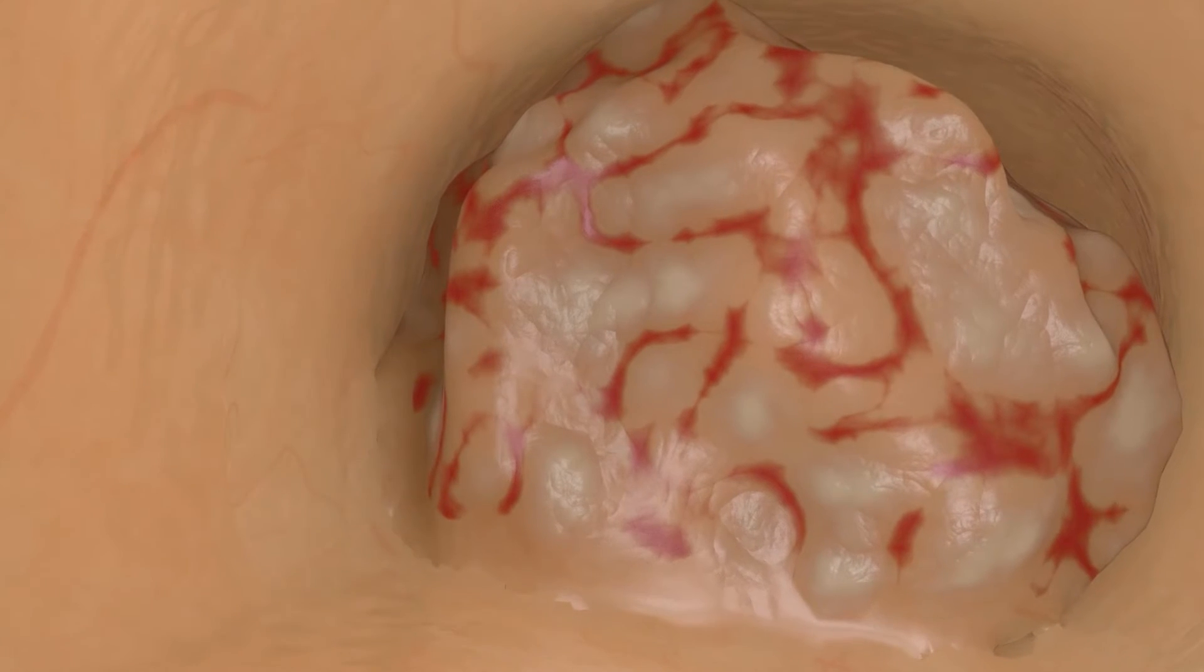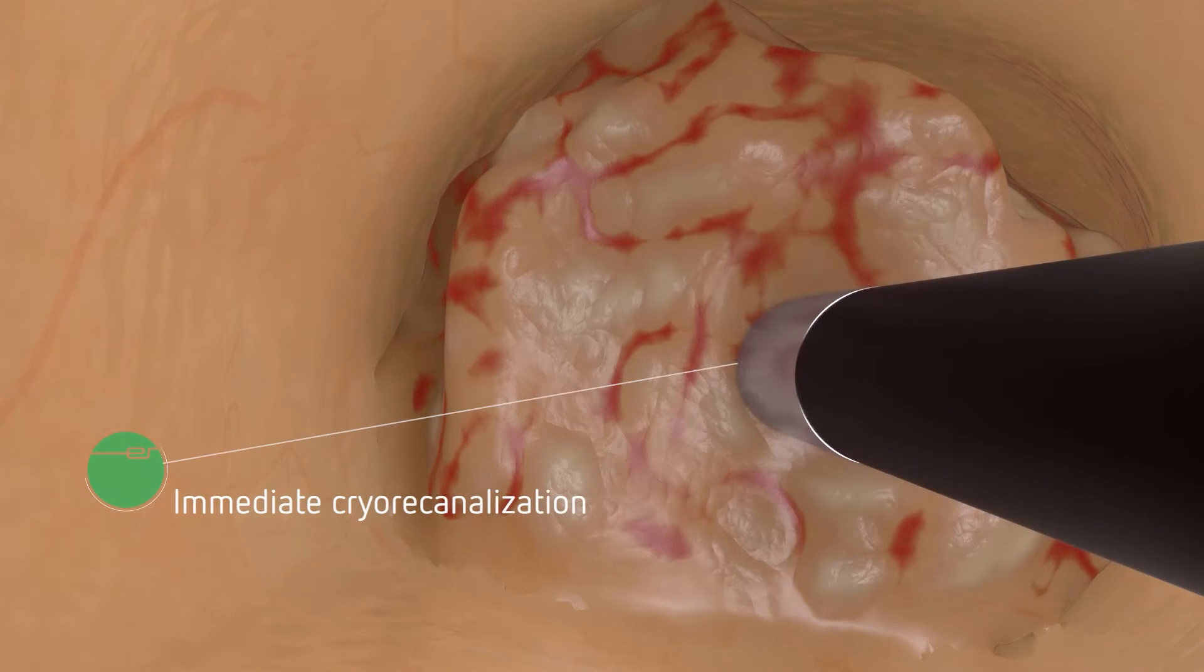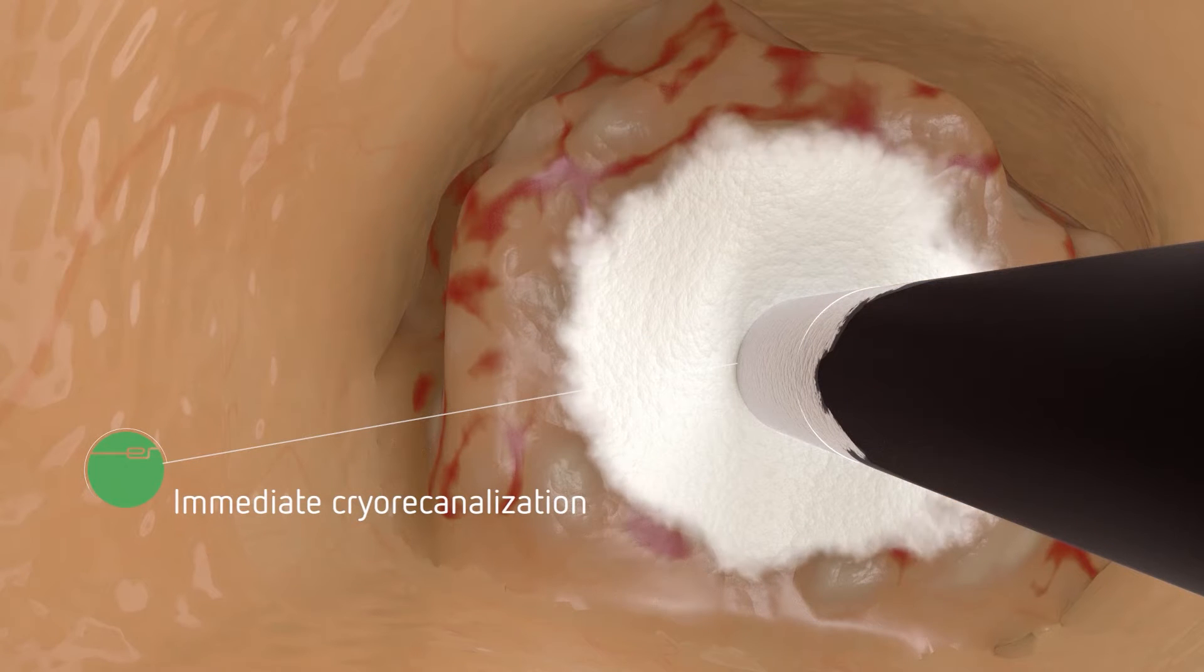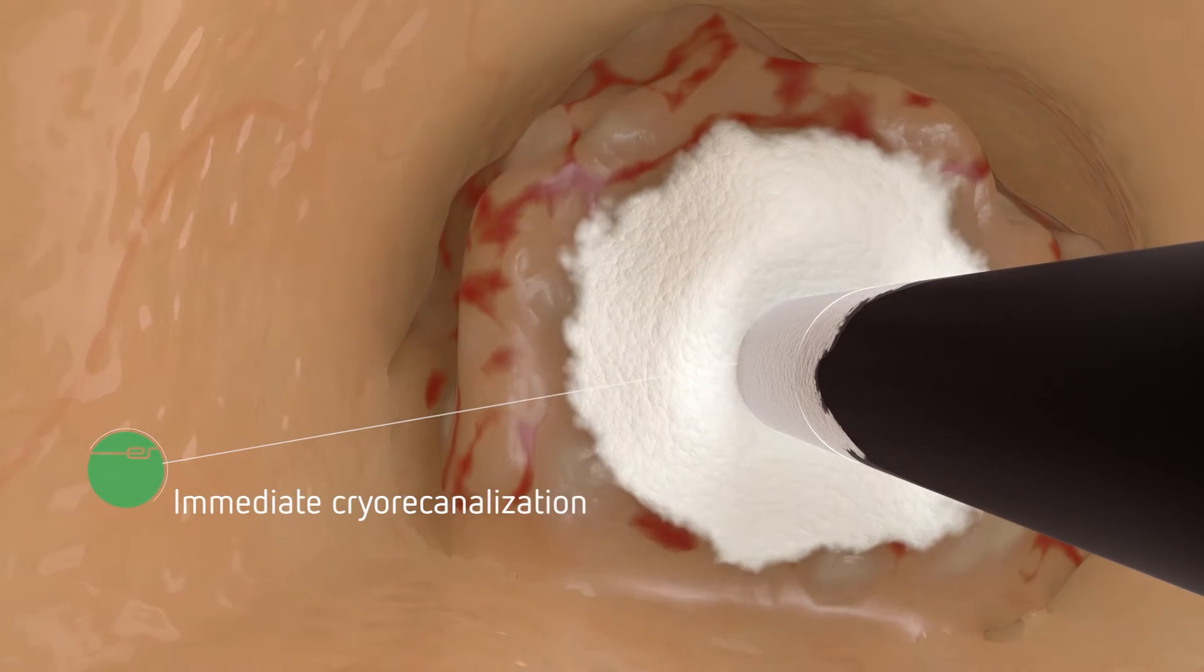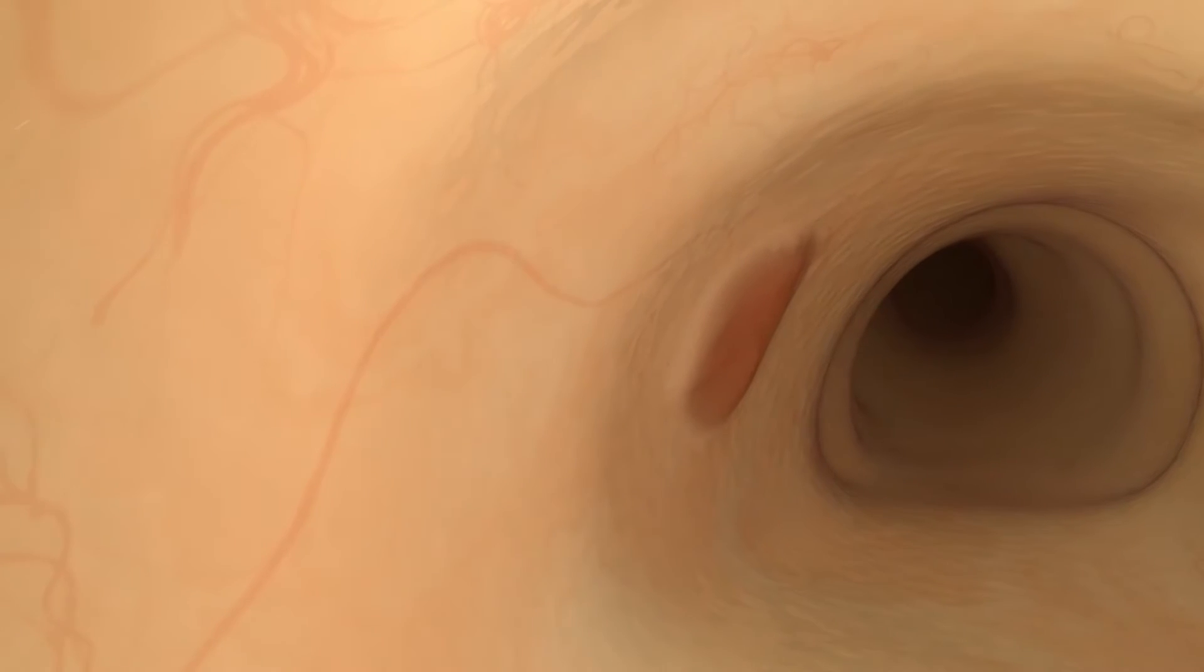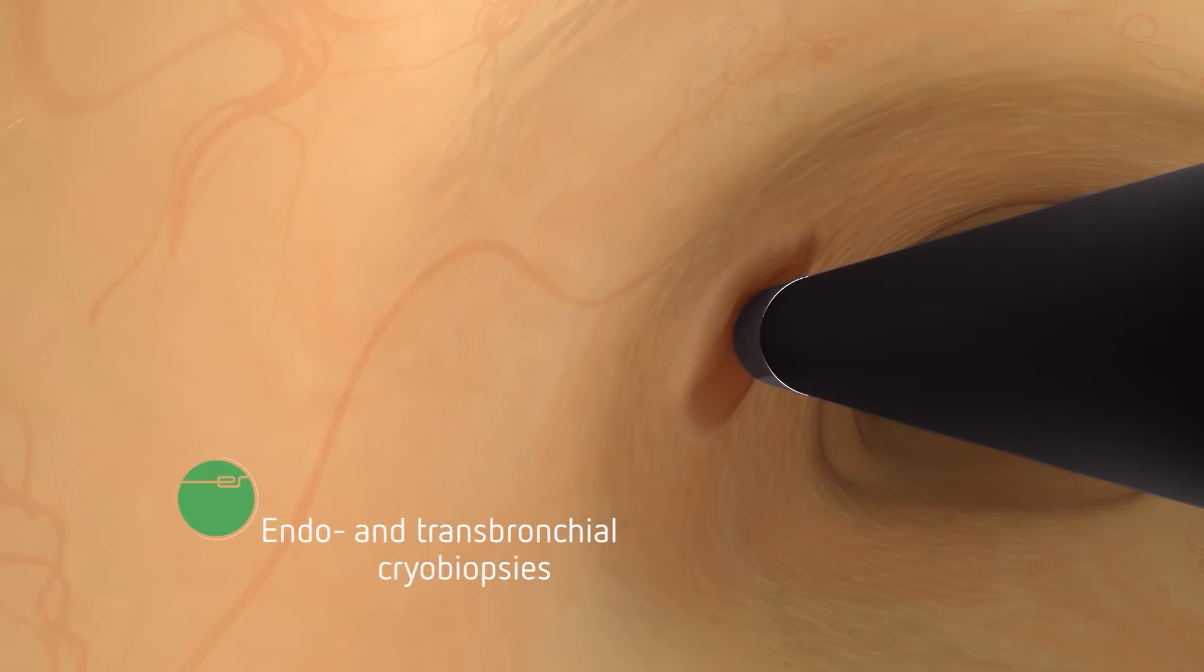Stenosis in the tracheobronchial tract, or to extract biopsies of superior quality.